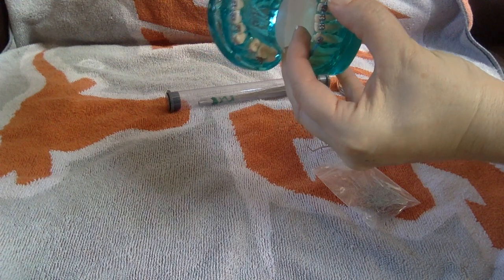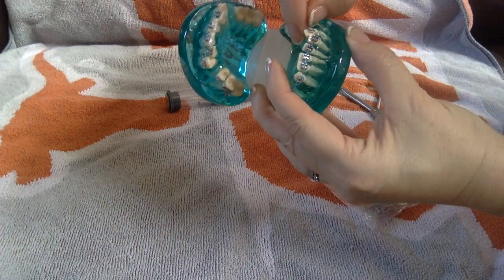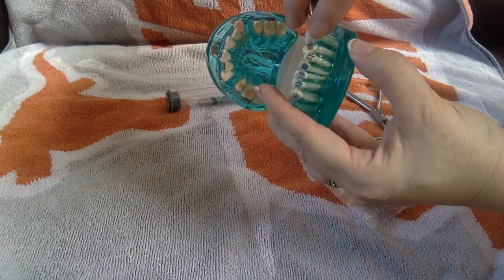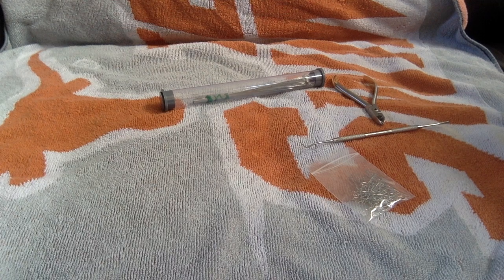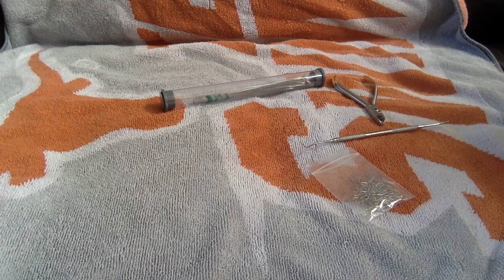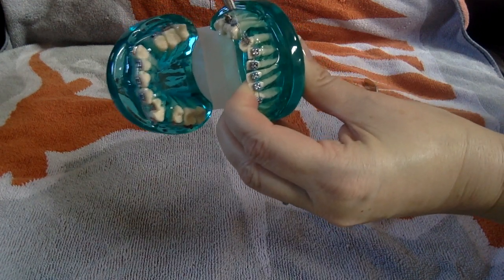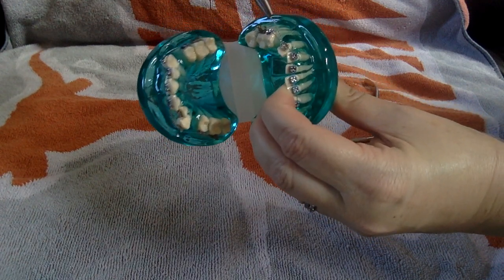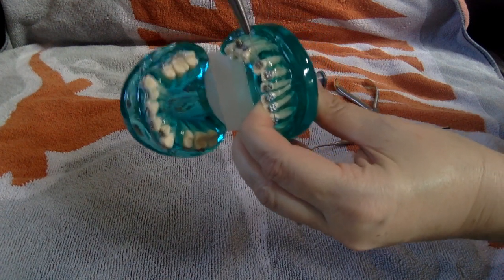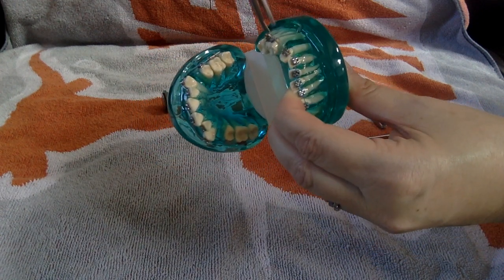Make sure you get around all the wings. The main thing is to have it grip all four wings — you've got to grab all four wings. Once you get around all four wings, go ahead and start twisting it, making sure you're pulling it nice and tight. There shouldn't be any slack at the end. Keep twisting until you start to see the wire double back on itself — basically forming a pigtail. If you twist it too much, it's just going to break.